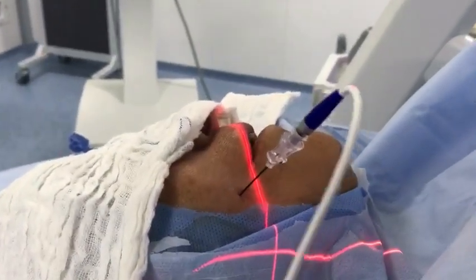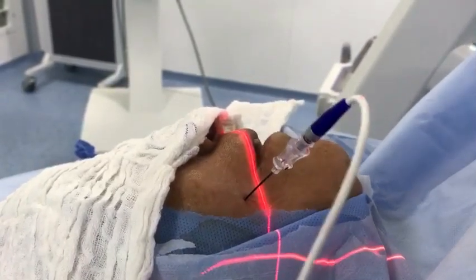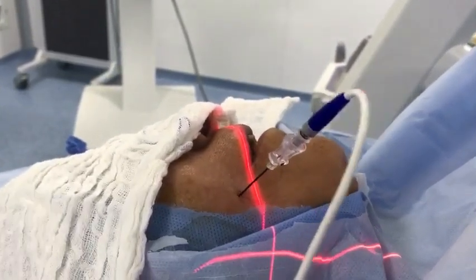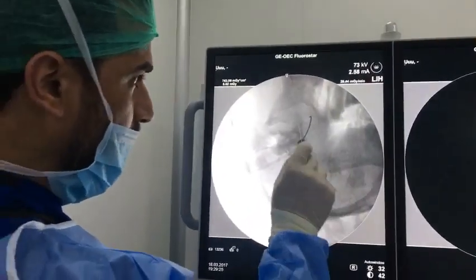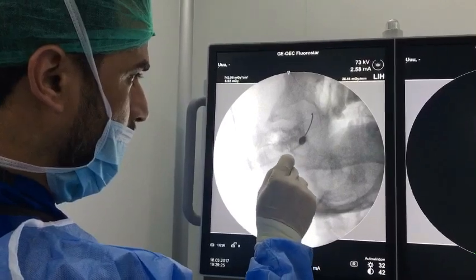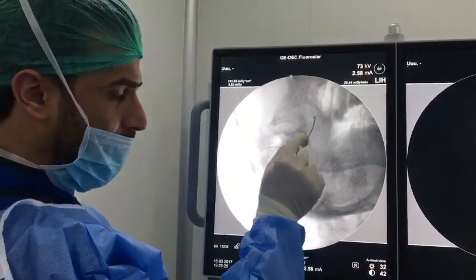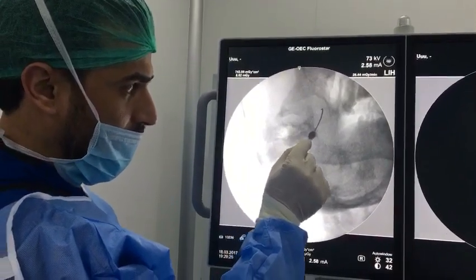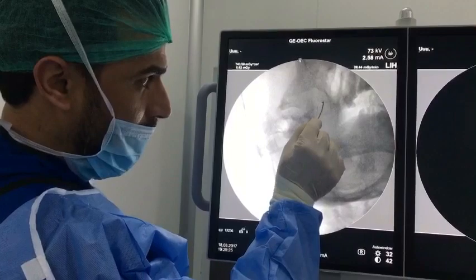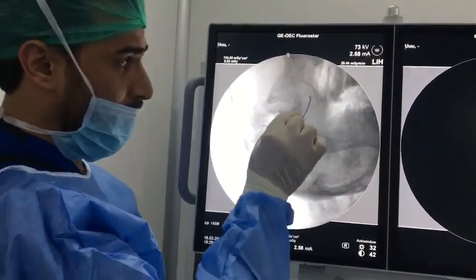Now I am very close to the mandibular branch, which is the main source of pain for this patient — V3. This is the mandibular branch. See the mandibular branch. This is the coronoid process and this is the condylar process of the mandible. And this is the mandibular branch.